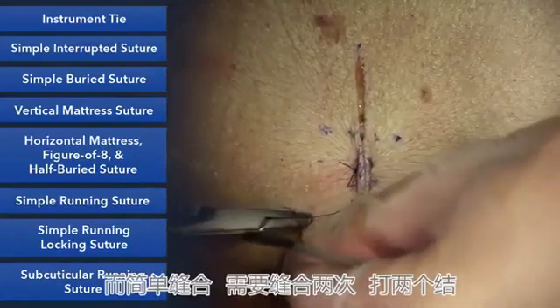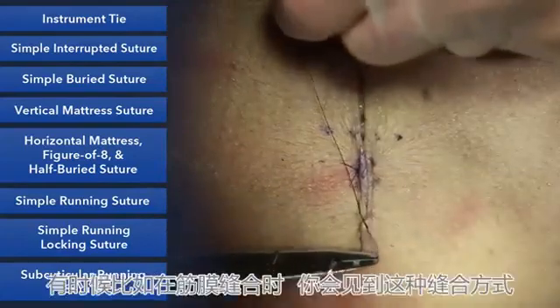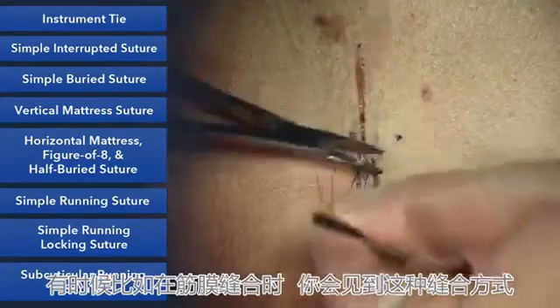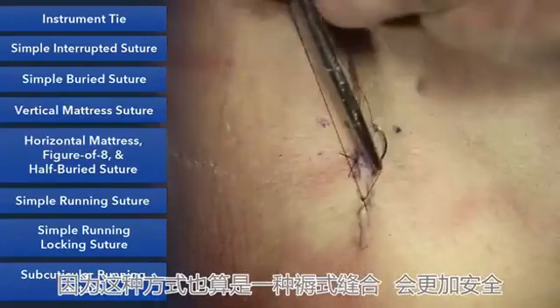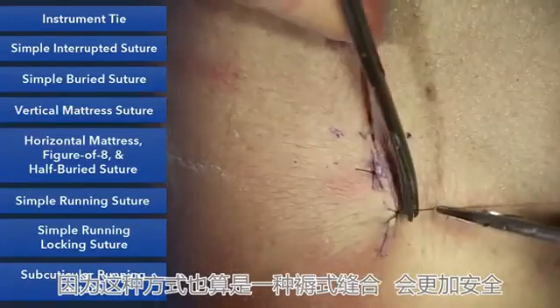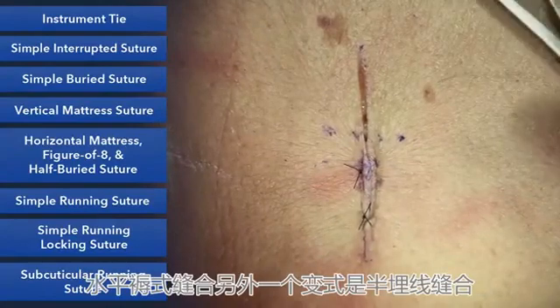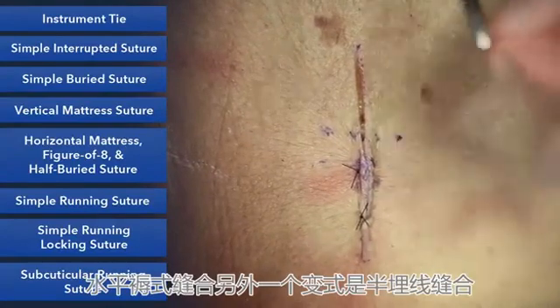Instead of doing 2 simple sutures and tying 2 simple sutures, you'll see this sometimes in some deeper closures like fascial closures, because again you're grabbing a bunch of tissue to a bunch of tissue, and therefore it'll be more secure. The final variant of the horizontal mattress is called a half-buried mattress.